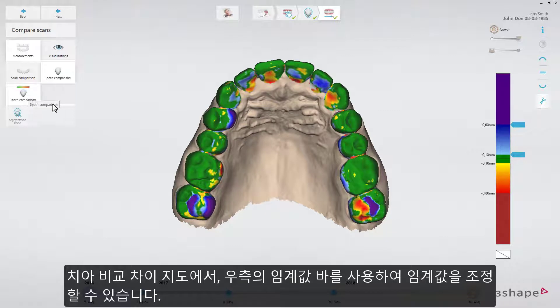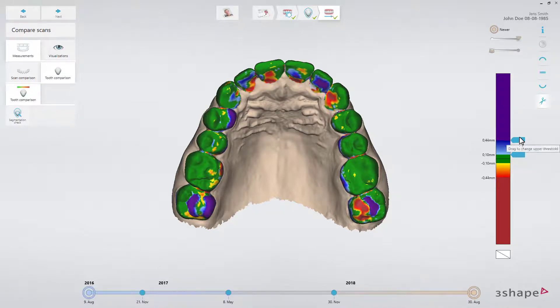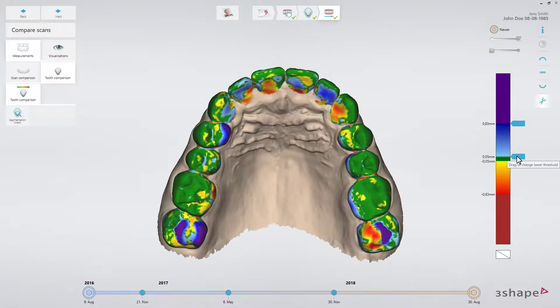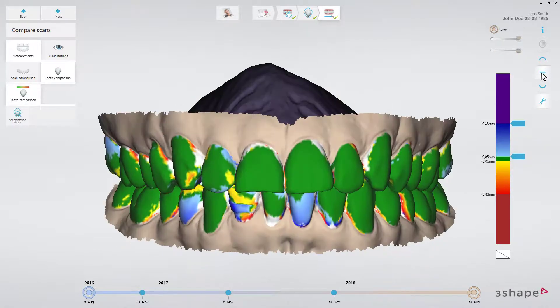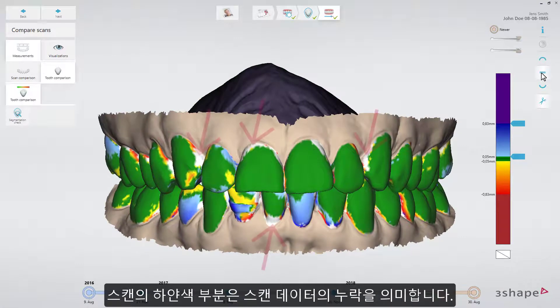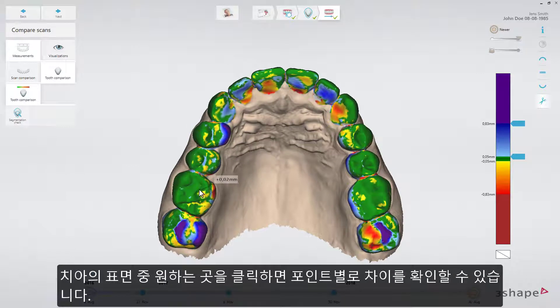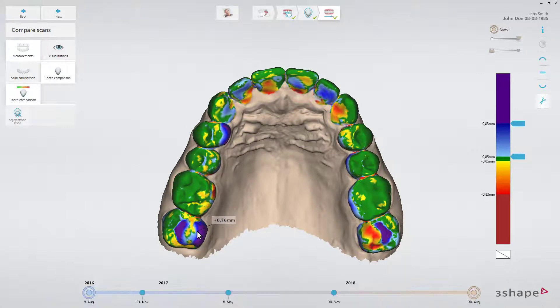In the Tooth Comparison Difference Map, you can adjust the thresholds using the threshold bar on the right. White regions indicate that comparison data is missing on one of the scans. Pressing on any point on a tooth surface will provide a point-specific measurement.